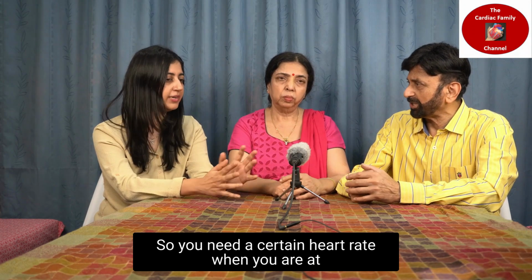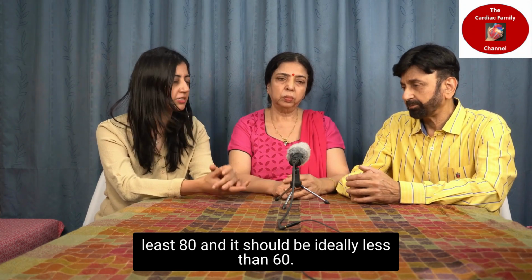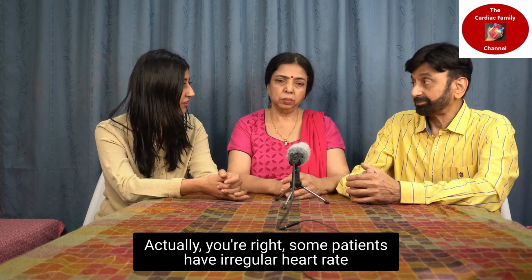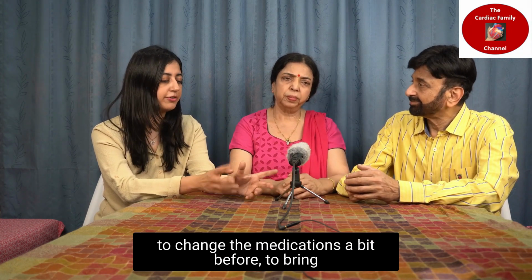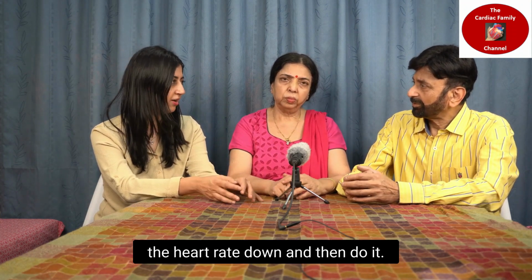The heart rate should be less than 60, at least less than 80, and ideally less than 60. You're right, some patients have irregular heart rates, like atrial fibrillation or multiple ectopics. Then you may not be able to do the CT coronary angio. You might have to change the medications a bit to bring the heart rate down and then do it.